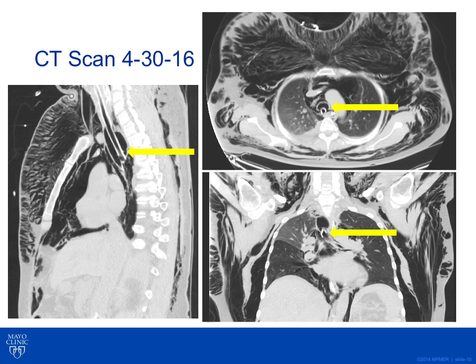On the coronal view, one can see the endotracheal tube just distal to the cuff, present just below the carina. The cuff is clearly inflated and perhaps a bit overinflated, causing the membranous tear to enlarge. On the left side, one can see the posteriorly placed endotracheal tube exiting from the membranous part of the trachea, with the balloon appearing to tear and extend the membranous tear to a length of approximately 7 centimeters.